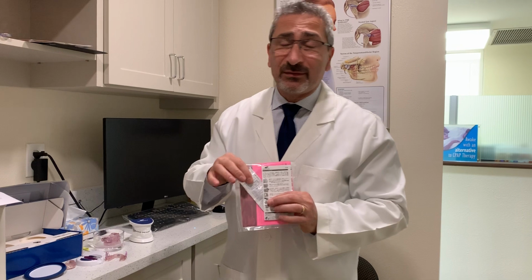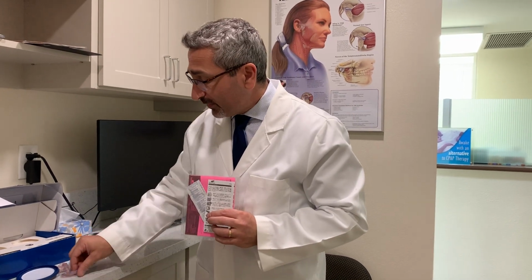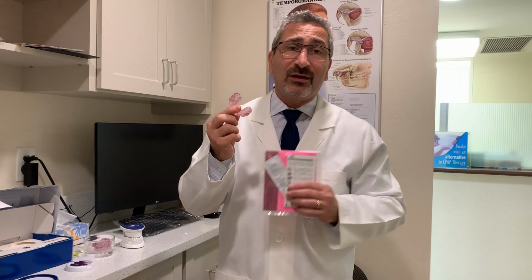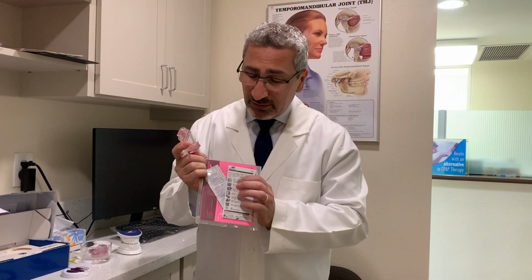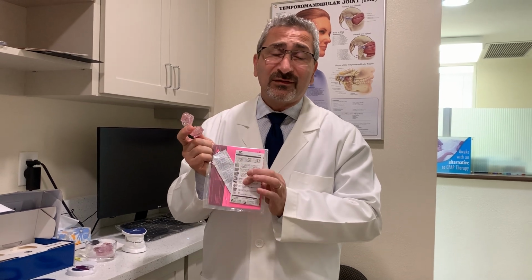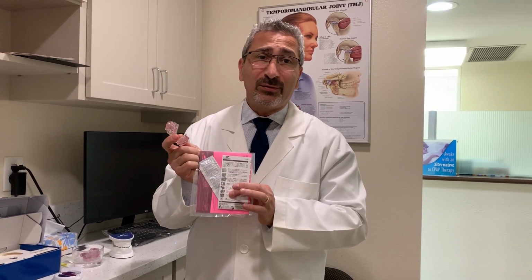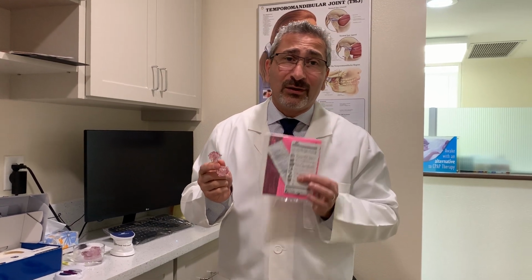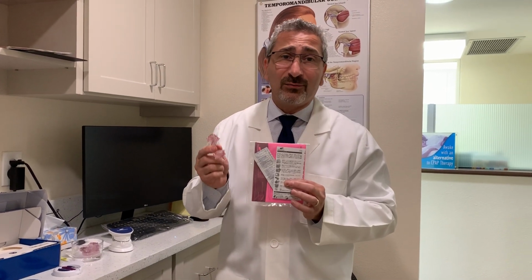Cleaning instructions. Every day you should be brushing and cleaning your mouthpiece. Every morning, every night, every time you brush your teeth, you should be cleaning the mouthpiece as well. Once a week you can use these tablets. Somnomed has given you a few samples. Once you run out, you can try using something over the counter, but I don't recommend using it more than once a week.